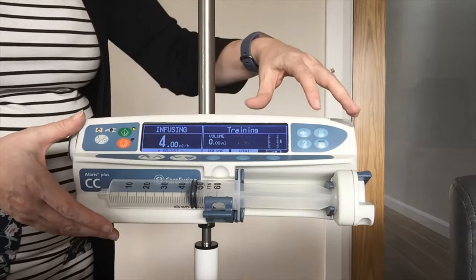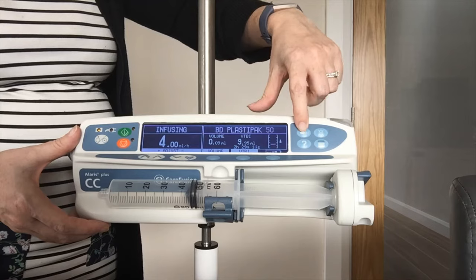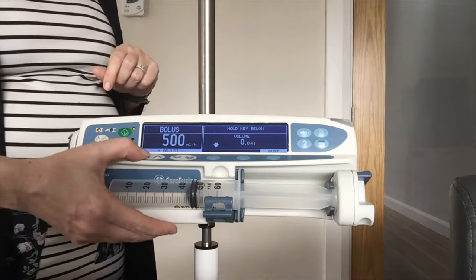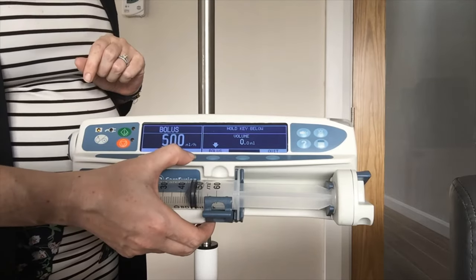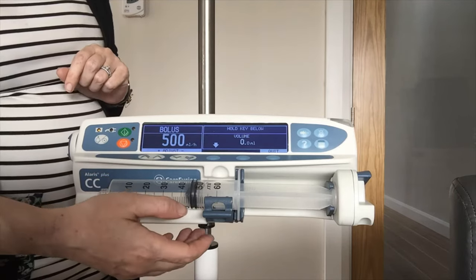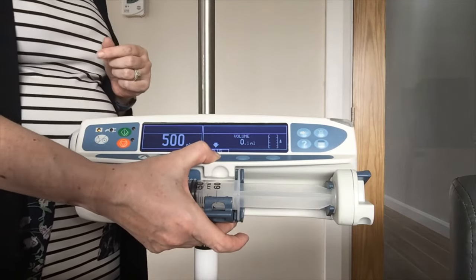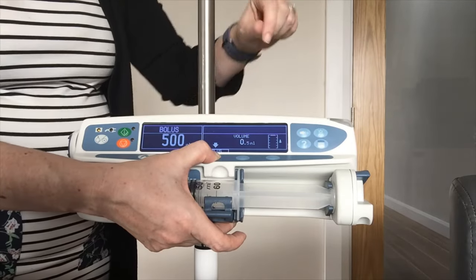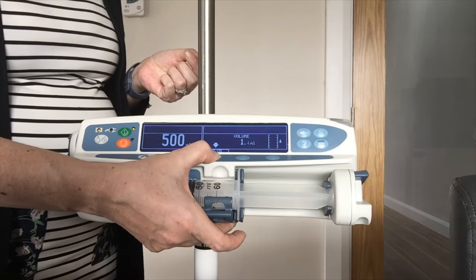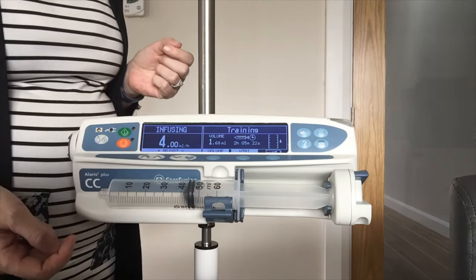Another important feature is your bolus. Over on this side we have four keys — the one with the syringe on it is your bolus key. Press that bolus key once and you have got a default rate of 500 mls per hour, but this can be adjusted using your arrows up and down to speed up or slow down the rate of your bolus infusion. To administer the bolus, press the flashing bolus soft key and keep your finger down — the amount shown is the amount the patient is receiving. Give your prescribed bolus, then take your finger off and that is included in your 24-hour fluid balance on the front of the pump.